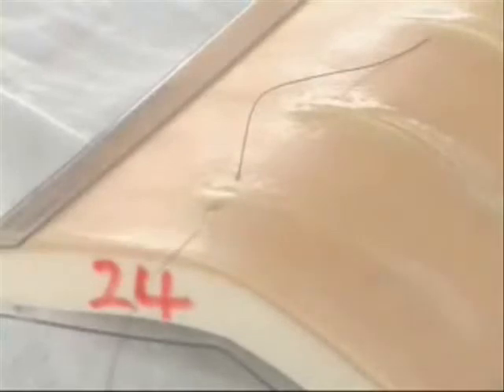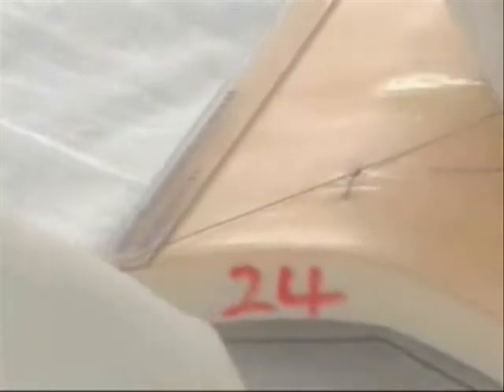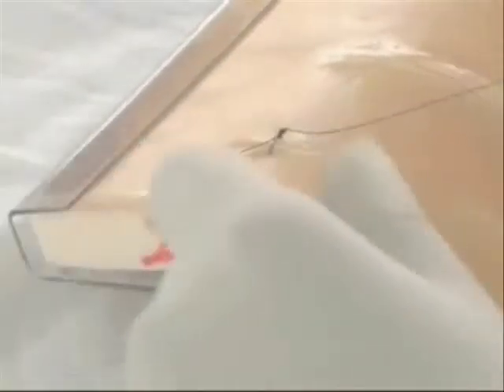Then I can drop the needle. I can tie either by hand or by instrument. I put three knots, and then I cut.